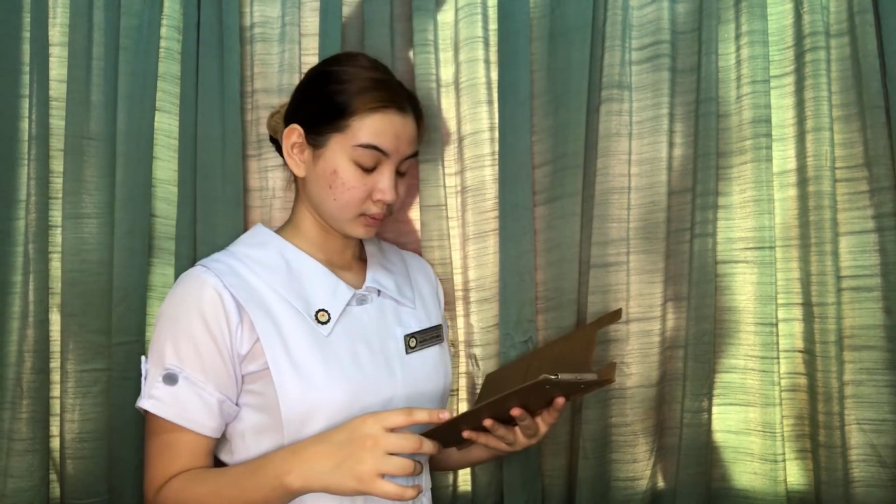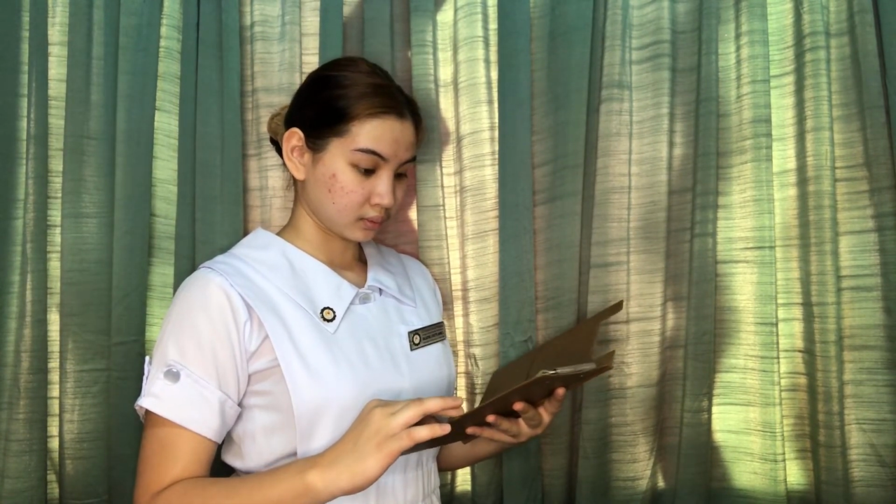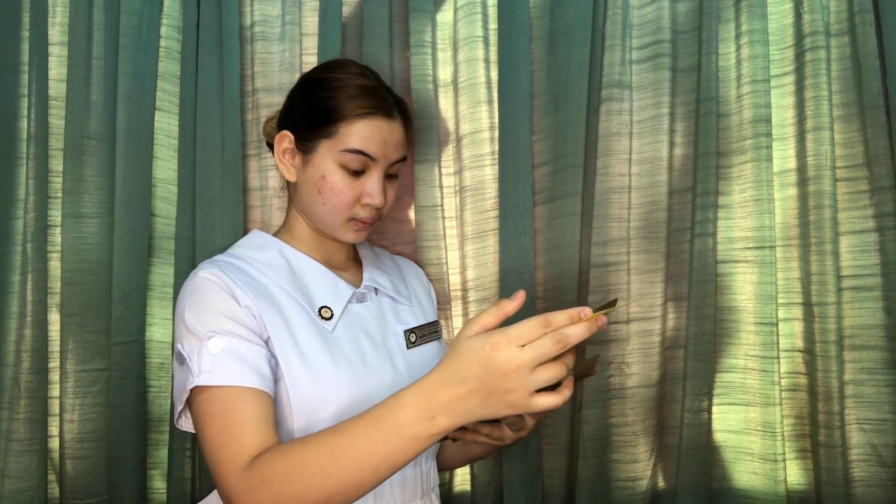First, we need to check the physician's order and then check the client's chart. The rationale behind this is for us to verify the procedure that we are going to do and to check if the client has any allergy.